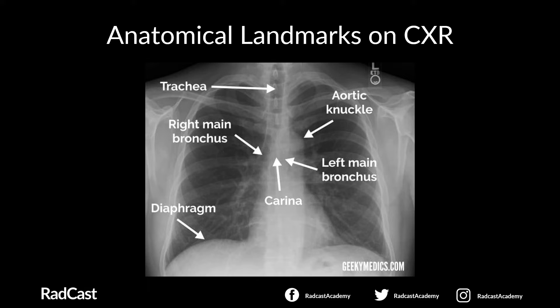It is essential to recognise key anatomical landmarks on a chest x-ray to safely confirm NG tube placement. These include the trachea, the right and left main bronchus, the carina (the bifurcation of the two main bronchi), the right and left hemidiaphragm, and the aortic knuckle — the chest x-ray appearance of the distal aortic arch arching over the left main bronchus. The oesophagus is difficult to visualise on a chest x-ray but typically lies to the left of the trachea and medially to the aortic arch.